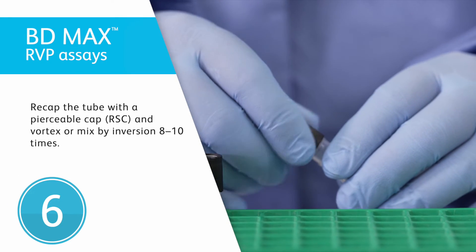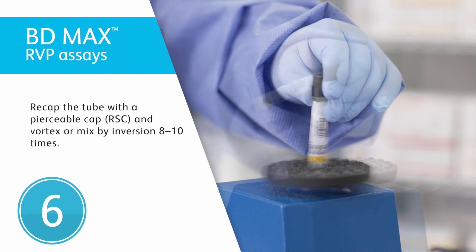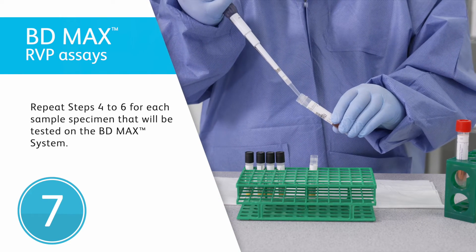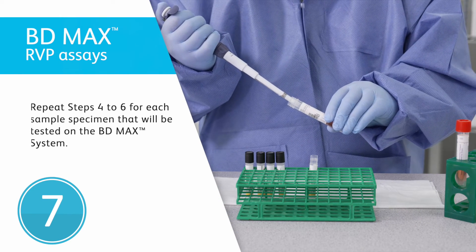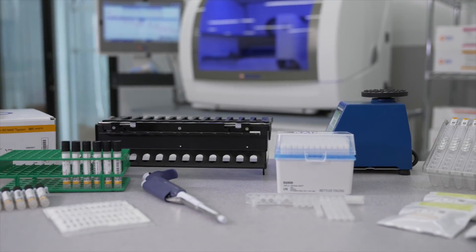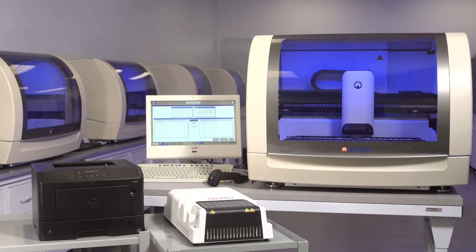Recap the tube with the pierceable cap, RSC, and vortex or mix by inversion 8 to 10 times. Repeat steps 4 to 6 for each sample specimen that will be tested on the BDMAX system. Now, proceed to the BDMAX system operation section in the assay-specific instructions for use to perform testing on the BDMAX system.